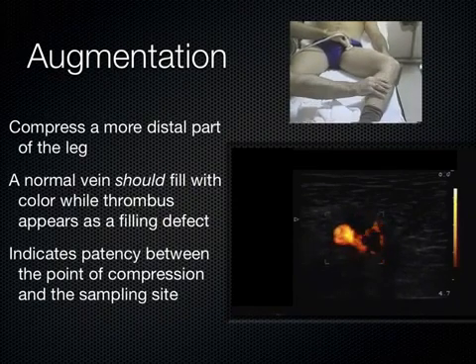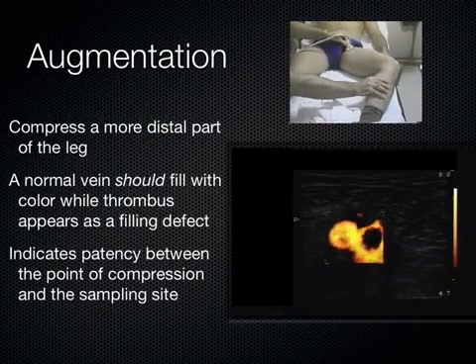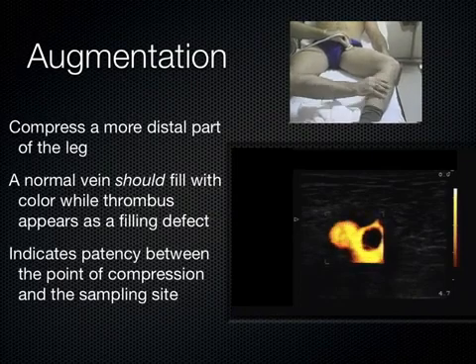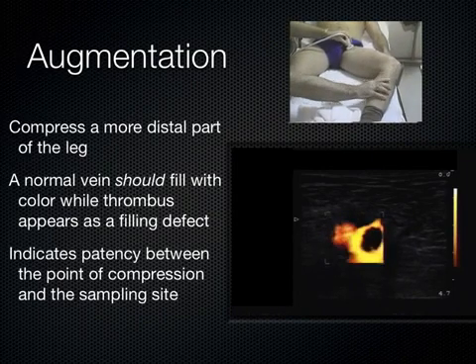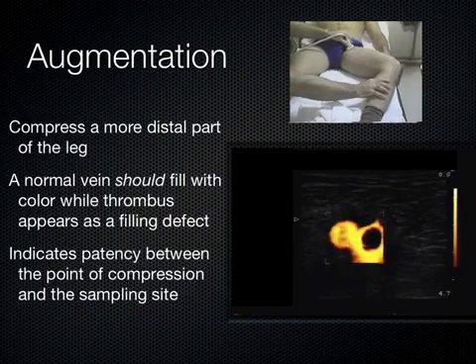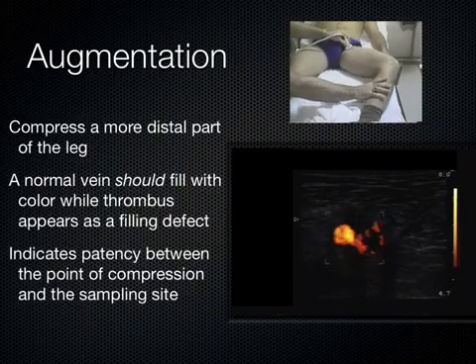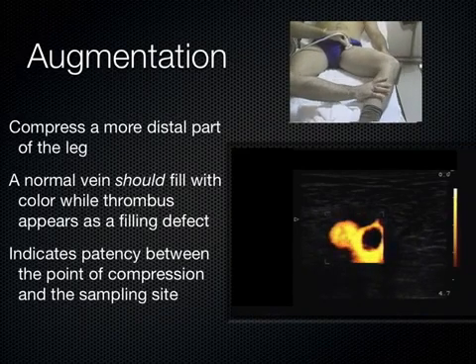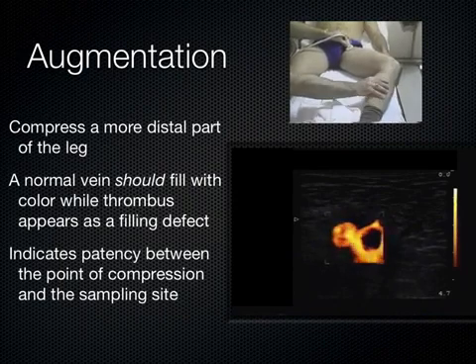And the problem with that approach is that it keeps a patient all night long in your hospital or your ER unnecessarily, one, and two, the majority of the time these studies are negative, like 90-something% of the time. And so you anticoagulate somebody unnecessarily, putting them at risk for the complications of being anticoagulated. And so this is going on all over the country still. It's amazing that this is happening. Still, it's so easy to do.